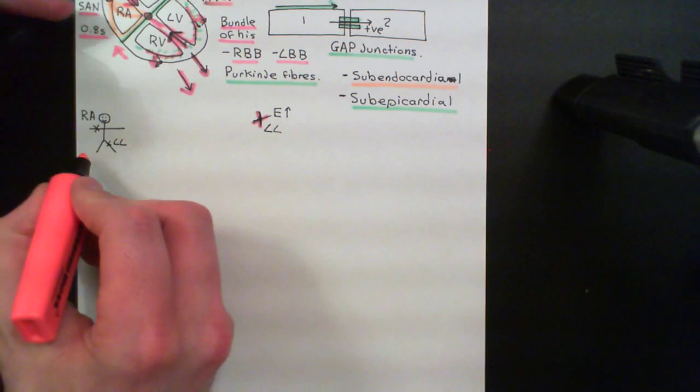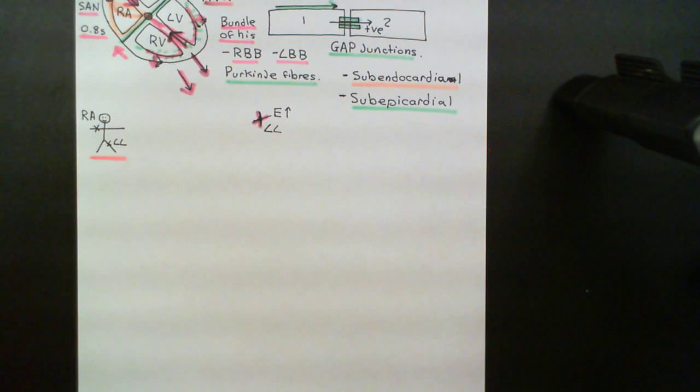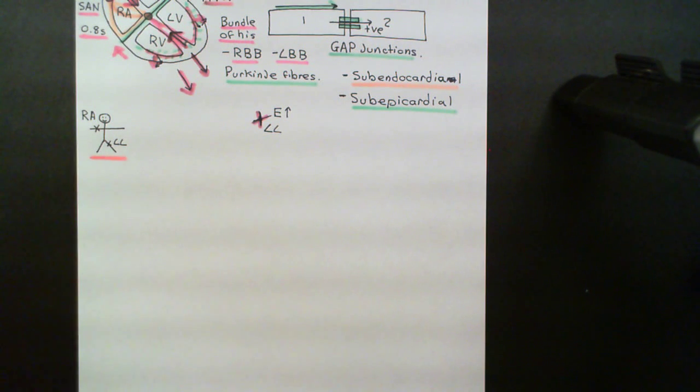This is the basic principle: we are going to measure the electrical potential difference between those 2. Because of the electrical activity in the heart, because of the currents moving around inside cells within the heart, we're going to notice changes in the electrical potential at these 2 points, and we see that by measuring the potential difference between the 2.